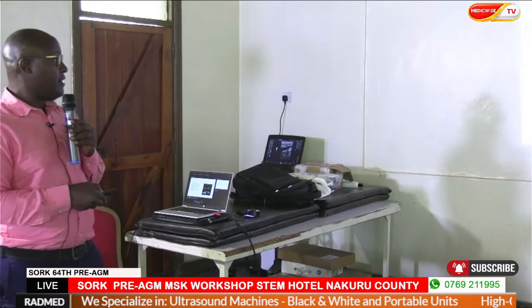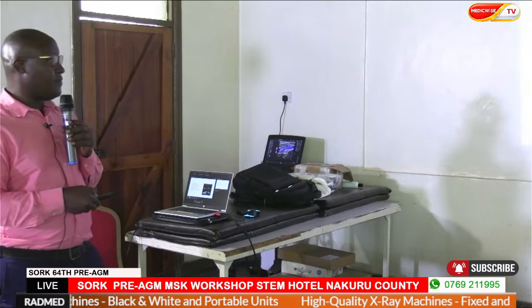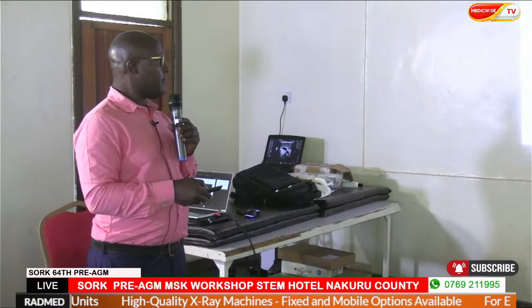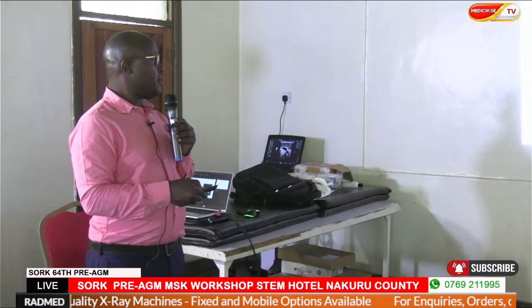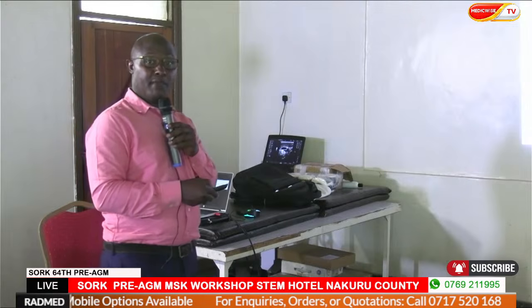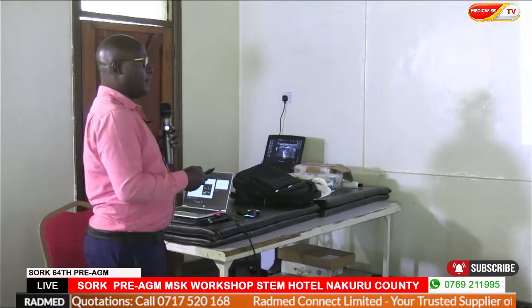So the bursa capsule arrows and the peribursal hyperechoic fat may have similar echogenicity and are difficult to separate. So here we have two structures, the bursal capsule itself and the fat adjacent to it. Since both are hyperechoic to muscle, we cannot discern which is which at ultrasound. And now this is the bicipital groove, and that is the long head of the biceps.